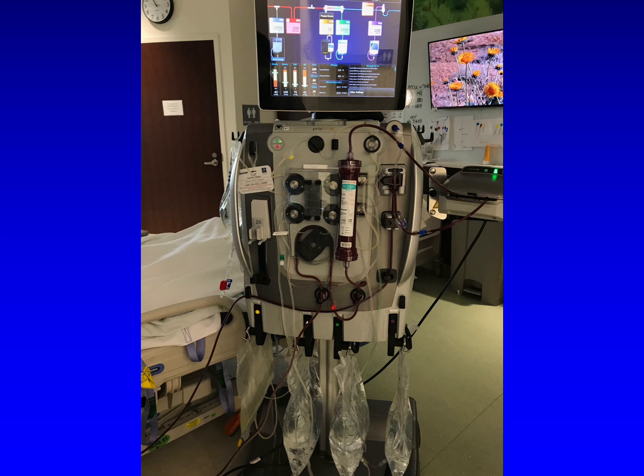So here's how a CVVH machine looks. Again, we have the patient's blood running through the hemofilter at a rate controlled by the roller pump.